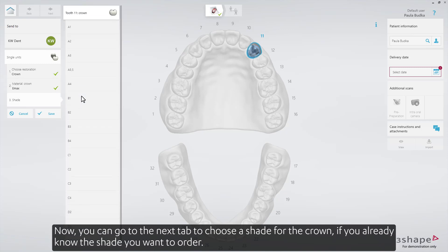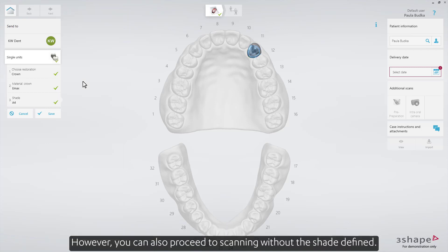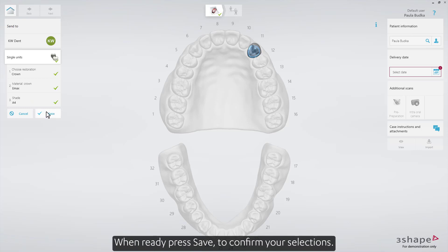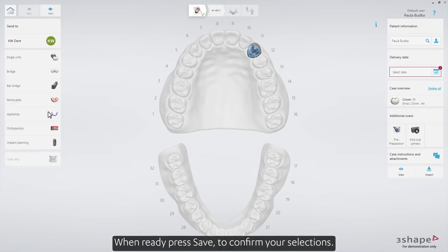Now you can go to the next tab to choose a shade for the crown, if you already know the shade you want to order. However, you can also proceed to scanning without the shade defined. When ready, press Save to confirm your selections.